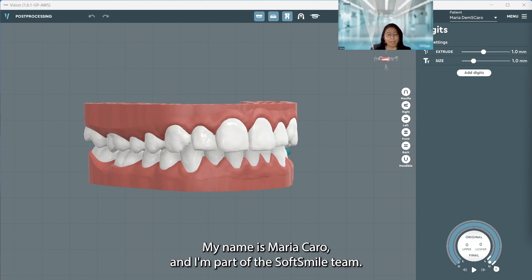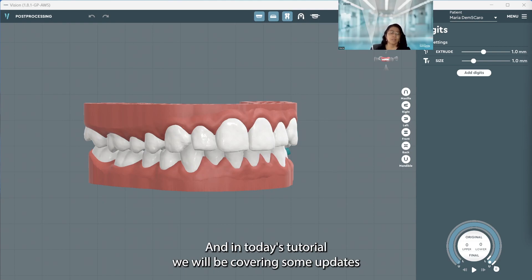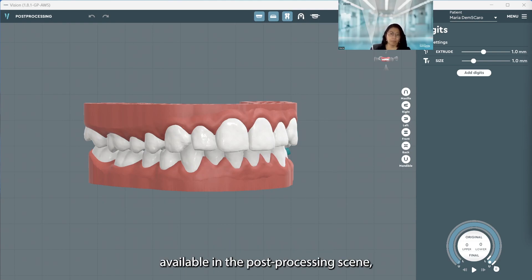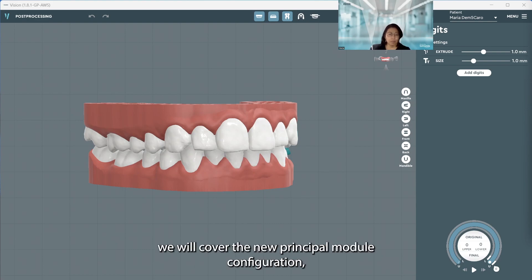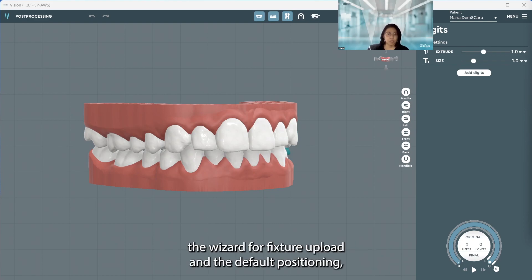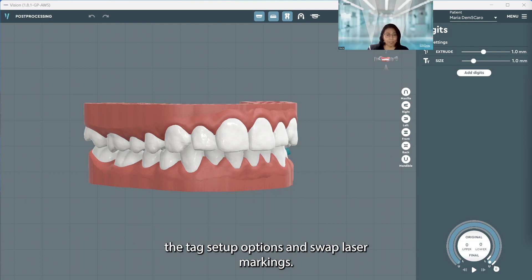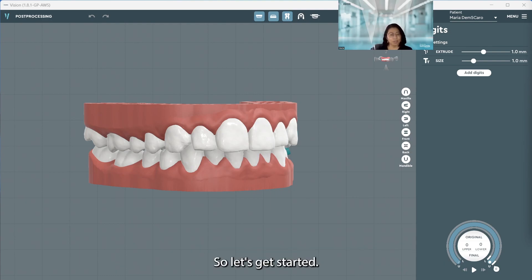Hello everyone, my name is Maria Caro and I'm part of the SoftSmile team. In today's tutorial we will be covering some updates available in the post-processing scene. Specifically in the settings, we will cover the new printable model configuration, the wizard for fixture upload and default positioning, the tag setup options, and swap laser markings. So let's get started.